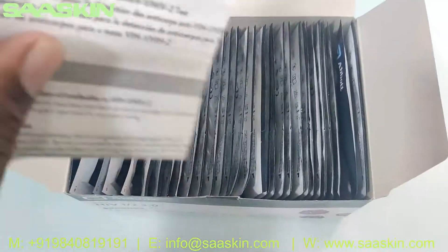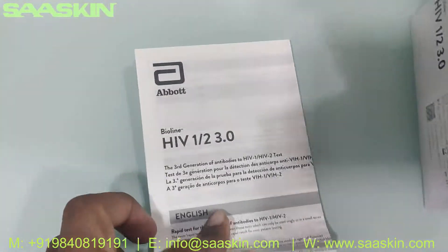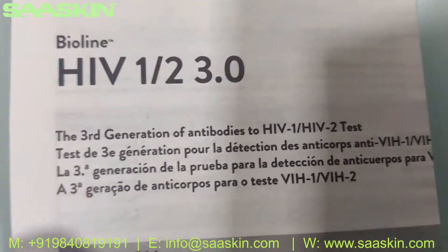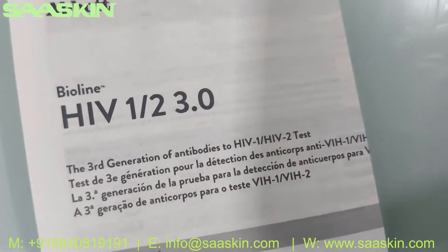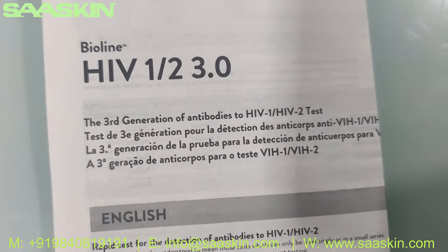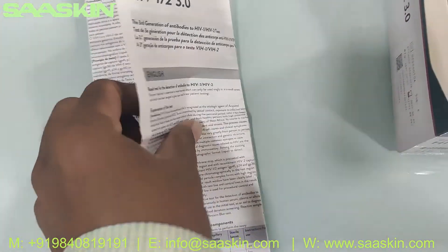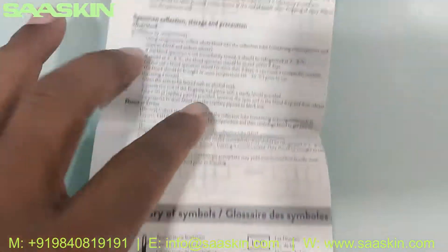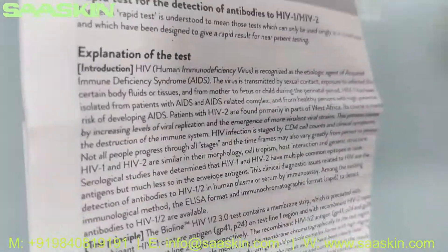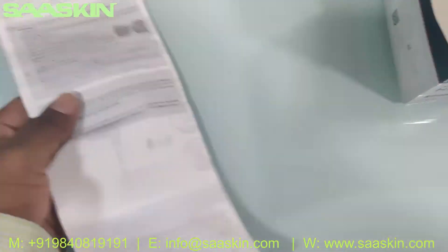Inside the box you get an IFU brochure — an instruction for use brochure — which is a detailed brochure. It talks about HIV-1 and HIV-2 third generation antibody test, used to detect that. It's a detailed brochure which covers how to prepare your samples, how to conduct the test, and also how to interpret your results. You get the complete details here.